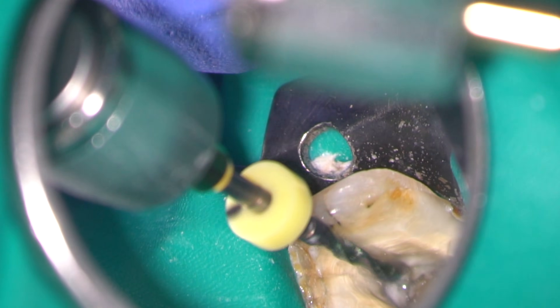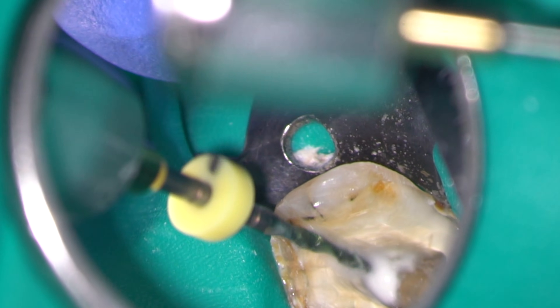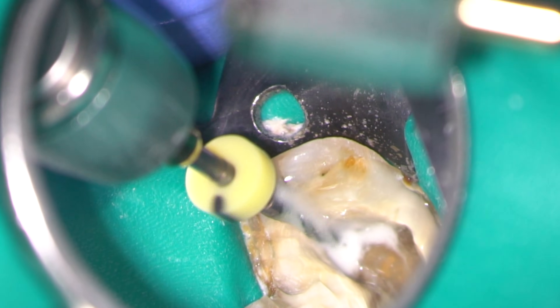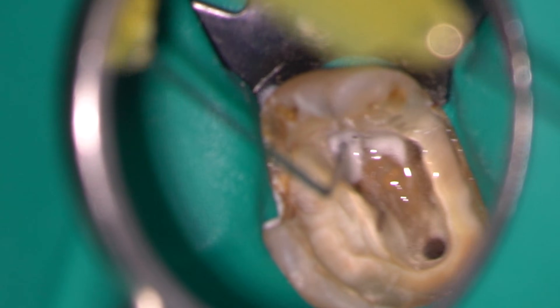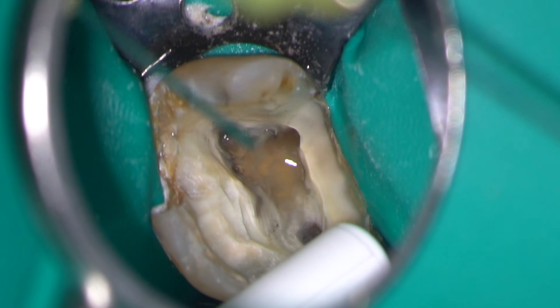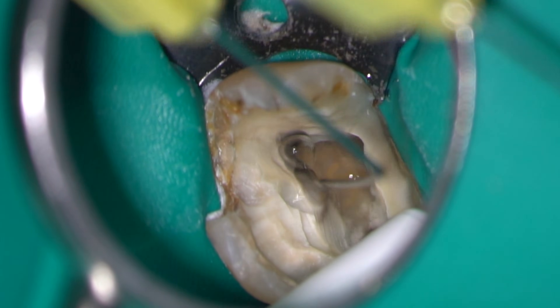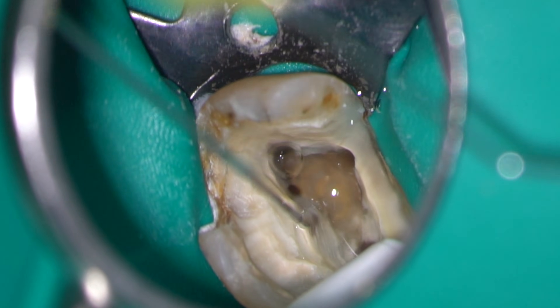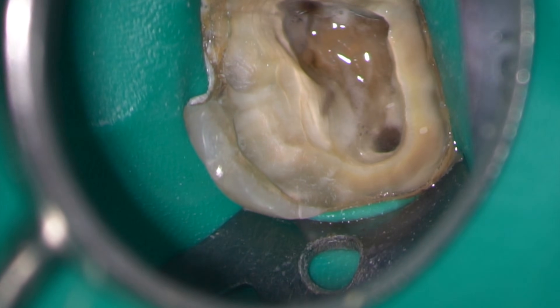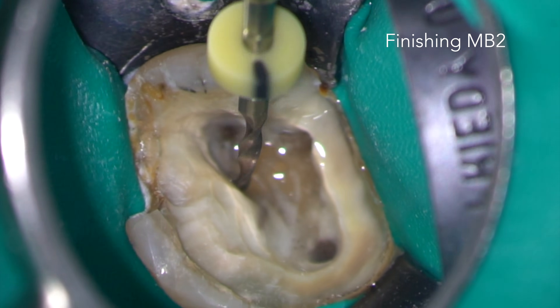This sequence of rotary or reciprocating instrumentation followed by irrigation and patency filing can be continued until the canal has been tapered to the full working length. It's important to keep irrigating frequently to make sure that the dentine debris is in solution and doesn't clog the root canal or cause the file to bind, which can make it fracture. Here I'm completing preparation on the more challenging MB2.